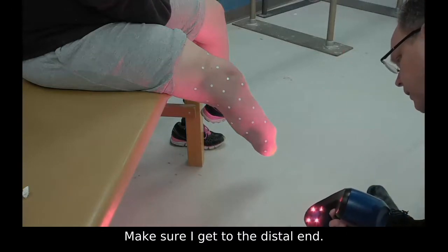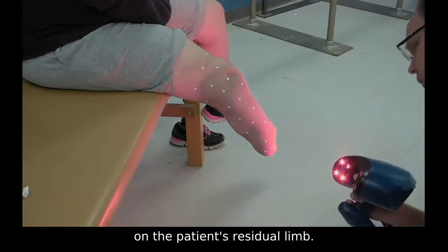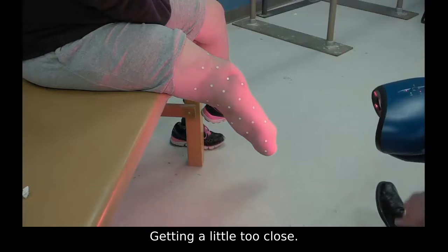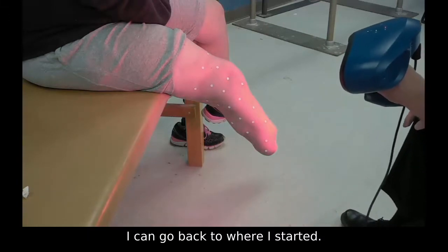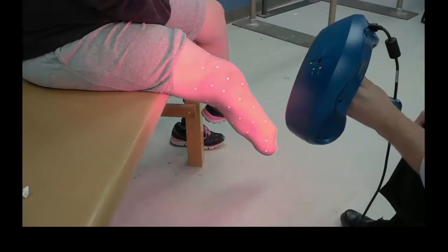Make sure I get to the distal end. And again, I can see the crosshair on the patient's residual limb, getting a little too close. I can switch hands. Again, if I feel like I'm not laying material down, I can go back to where I started, and the computer will reset and lay down material.